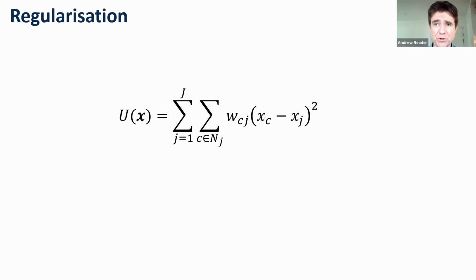And so this is a very simple quadratic, like a Tikhonov regularization, if you like, that we could use for PET, where we're just looking at differences between pixel values. We're basically saying noisy images will have large differences, which gives rise to a large square, and therefore a large energy, which means a low probability of the image. So we're seeking image estimates that will deliver small values for this.